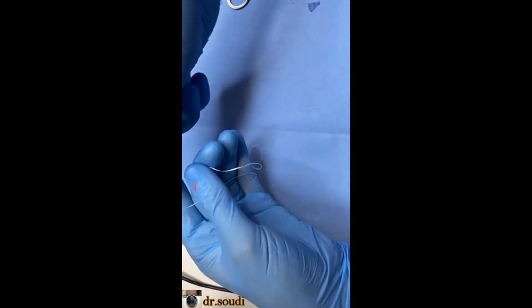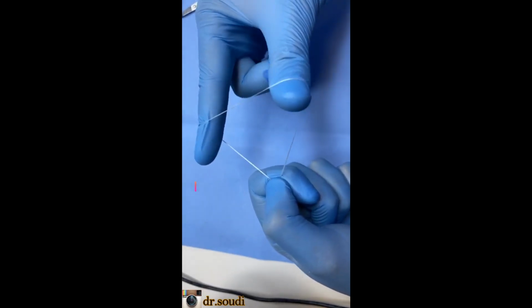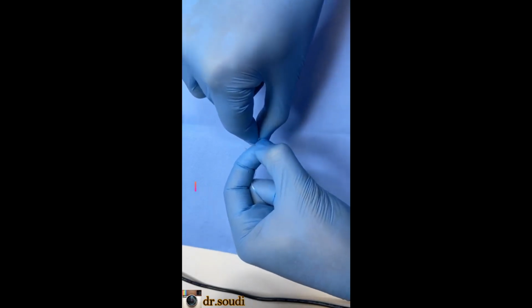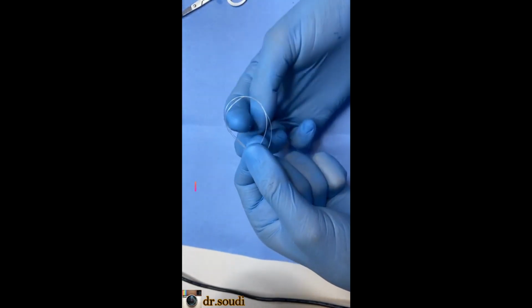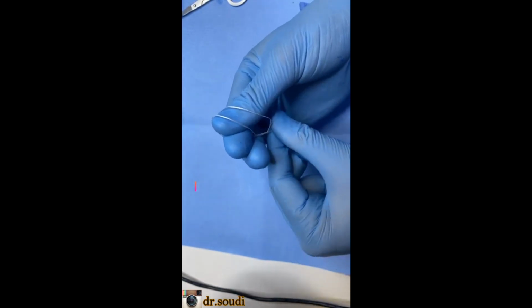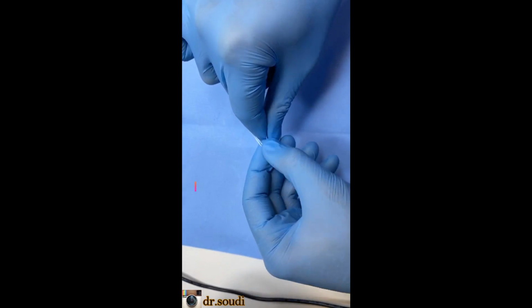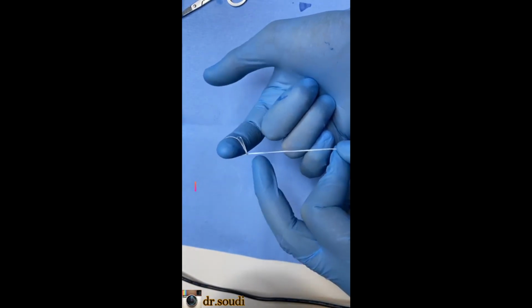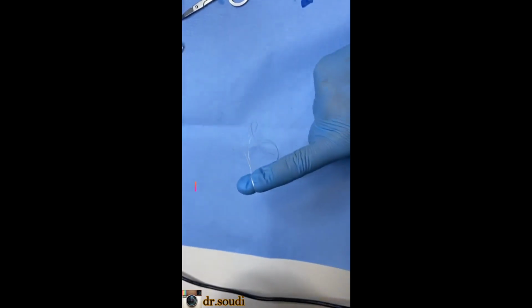The same floss, divided into 2. If you are making one, make it triangle downward like this, and take this tip, this part like this, and you got a one tie. Don't close it, the same as we did with the one. The same we did the triangle, and we take another one, and press this. You got two ties. Look, this is one tie and this is two ties. Press and you got two ties. You move the tie like this and you will have the tie.